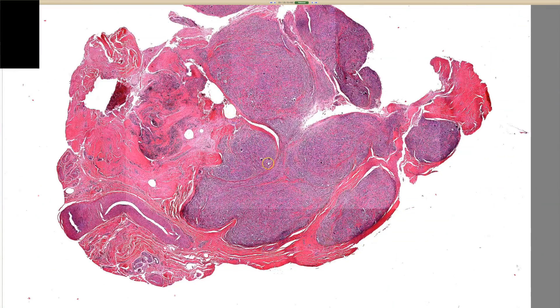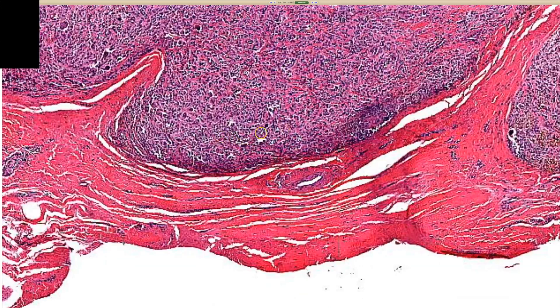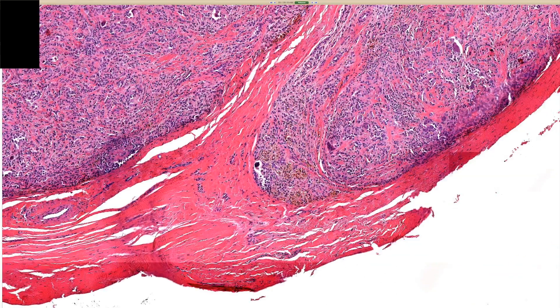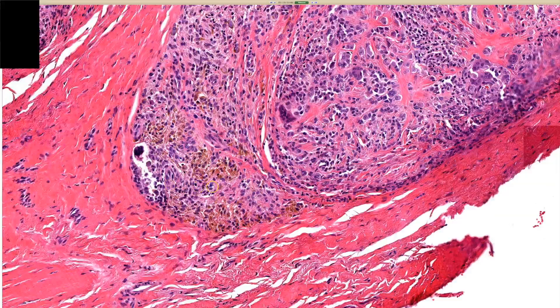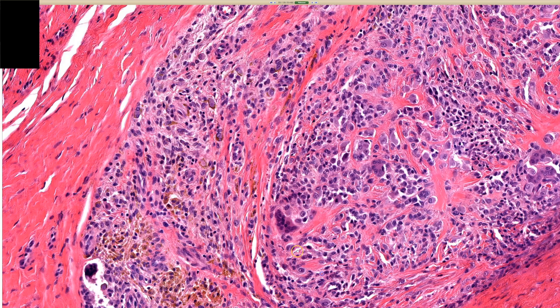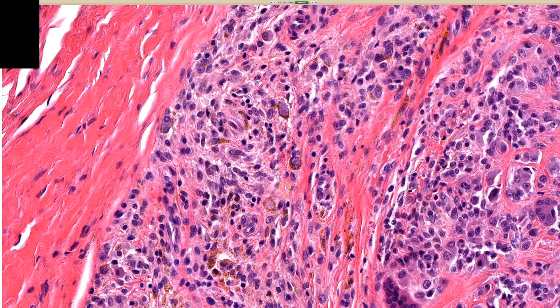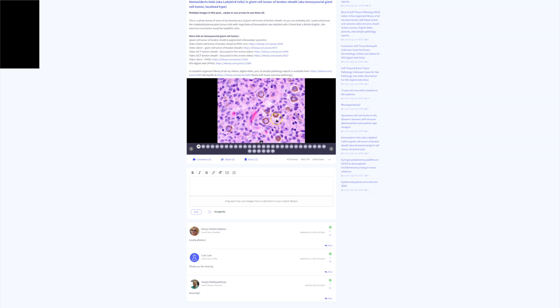Usually there will be foamy histiocytes or xanthoma cells around the outside — I looked for a while in this case and couldn't really find those. There will also usually be hemosiderin present at least focally, sometimes very abundant. Here's hemosiderin, and it has a tendency to do this interesting thing where it makes a halo or ring around the periphery of these tumoral histiocytes. I've got some really good pictures to show you of this.